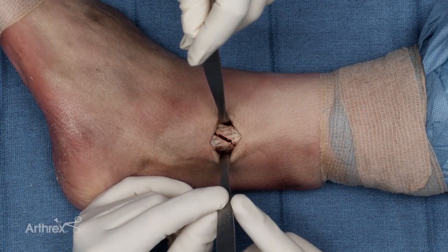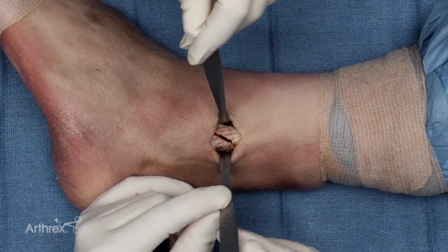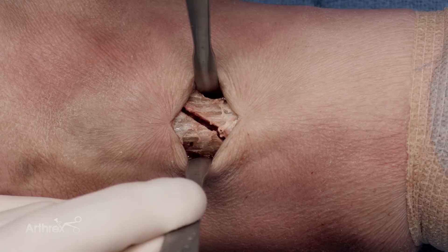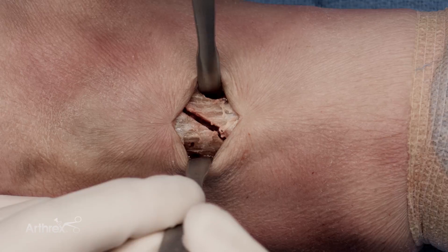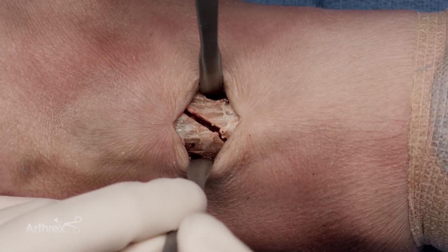I've cleaned out the fracture site and defined the cortical edges to be able to know if I'm anatomic or not, and now I'm ready to reduce. One key thing for this reduction maneuver is to pass the cerclage tape before you put the clamp on, so that you don't risk knocking your clamp off during the passing portion of the cerclage tape.